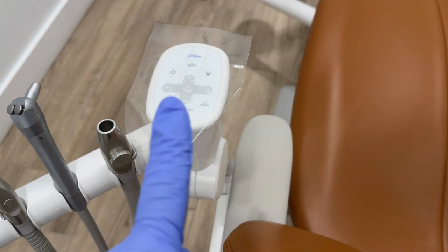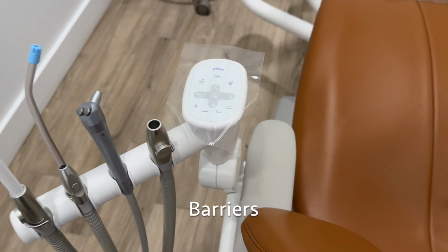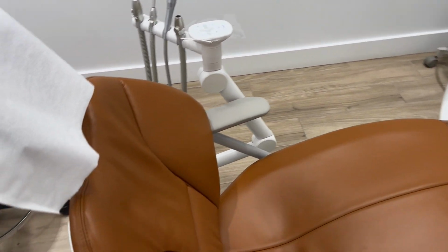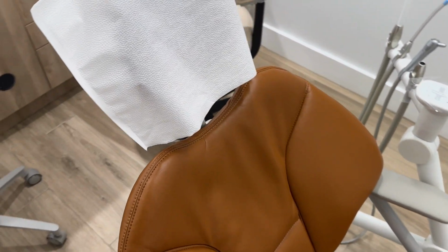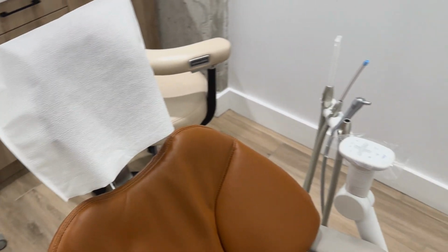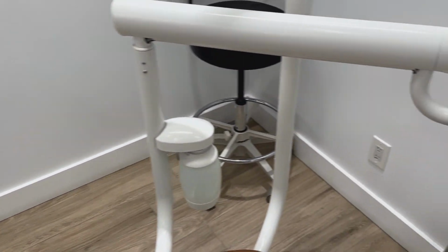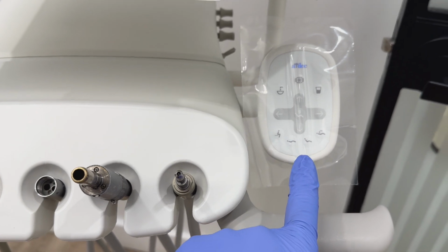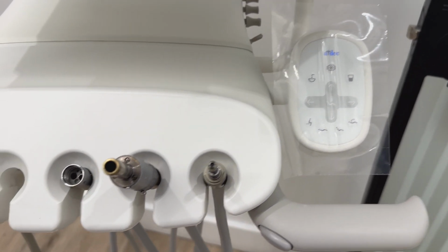First things first, barriers. Make sure that you have barriers on all of the appropriate equipment, such as your control panel for the dental chair, your headrest. A few things that I didn't cover quite yet are the individual air water syringes. Will typically need barriers, the control panel on both the dental assistant and the operator side.